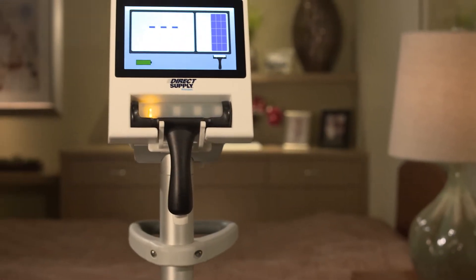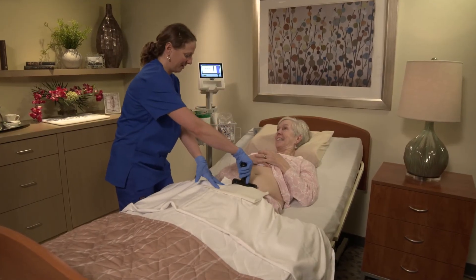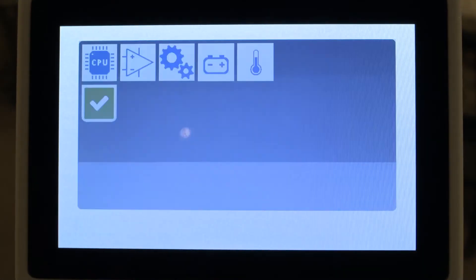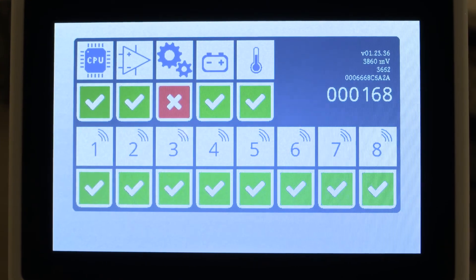The Attendant Prodigy Bladder Scanner does not require annual calibration. Performance checks are automatically performed during each scan. If any of the components measure outside normal operating specification, the scanner probe sends an error message to the console rather than display a compromised volume result.